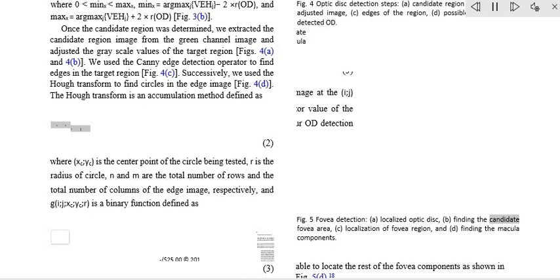Finally, we used 2 color-related features to represent the color information of the images. The first feature is concerned with the pixel intensity distribution properties of a retinal image. It is expected that the histogram distribution of a high-quality retinal image should be similar to a normal distribution. Therefore, we calculated the high-order statistical properties of the gray level histogram to represent the intensity distribution of a retinal image. The second feature represents the dominant color of the image in both the RGB and gray scale color spaces.